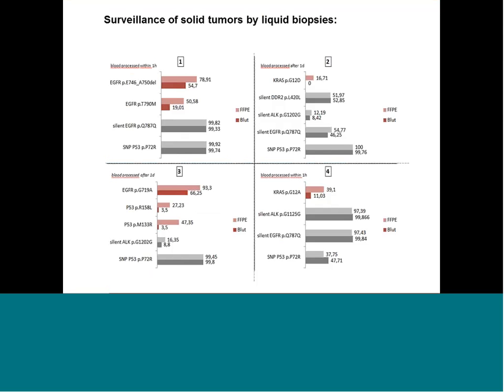And as surveillance, this has also been a question more recently. Can we monitor these mutations also in the blood of patients? And indeed, this is a very beautiful example. A typical exon 19 deletion mutation in exon 19 of EGFR. Patient received Tarceva, and in the blood we found this T790M mutation. If you remember my first patient, we don't have to rebiopsy these patients, but we can detect the mutations in the blood. However, this is a very sensitive technology.